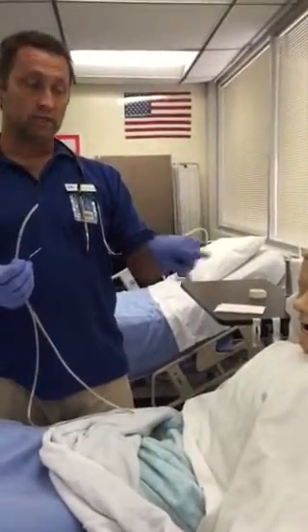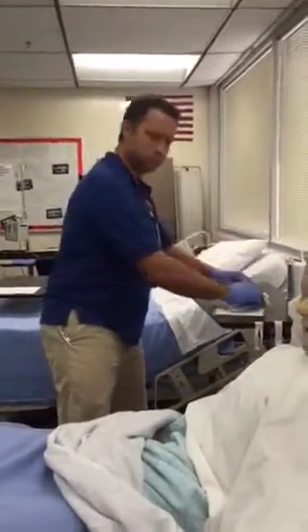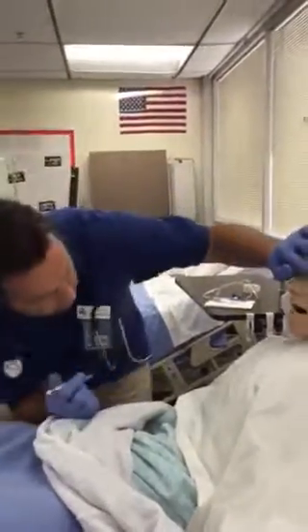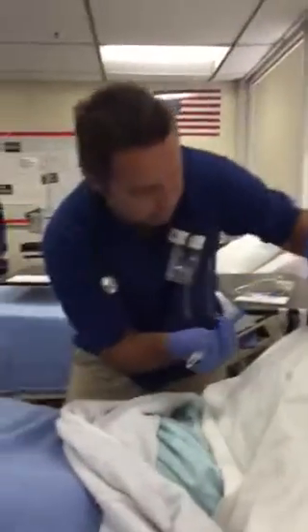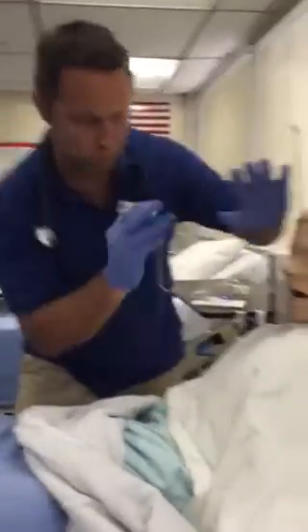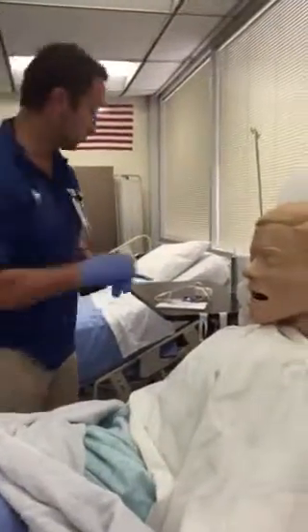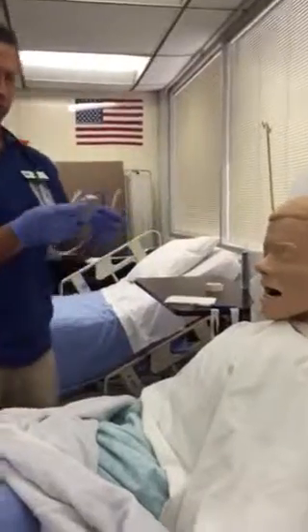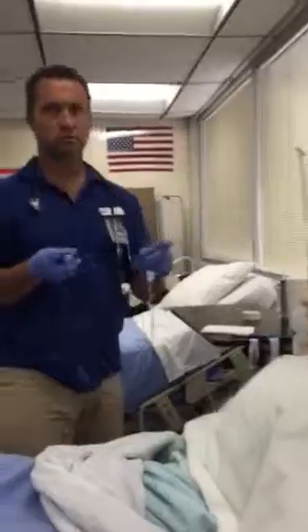What I need to do is decide which nare to go into. So we would assess his nares. What I'm looking for is a deviated septum, with a pen light. I want to occlude one nare. Breathe for me in and out through your nose. And so we want to make an intelligent decision of which nare we're going to use for the procedure. Then we would have taken our tube and lubricated the end 4 to 5 inches.